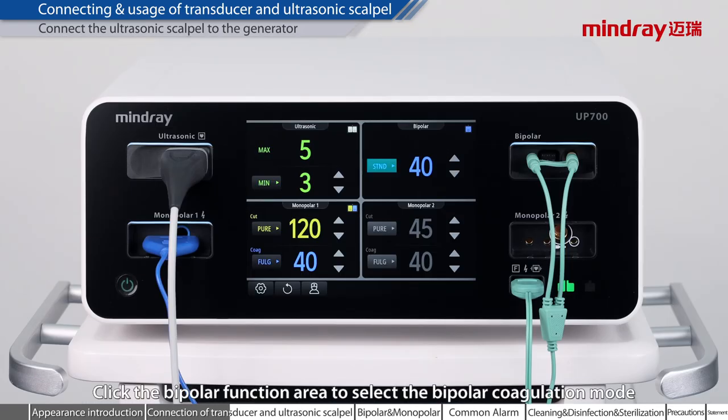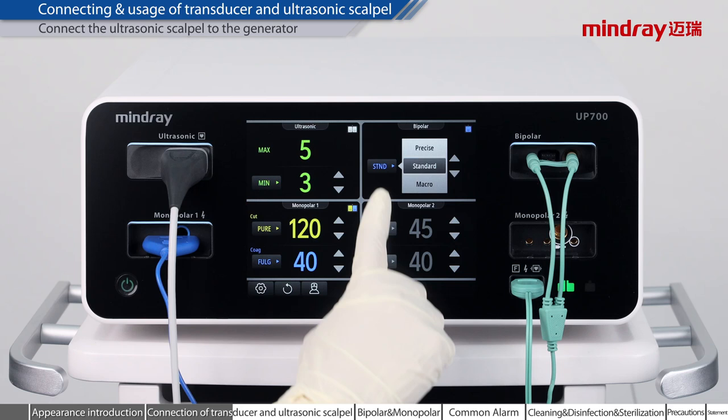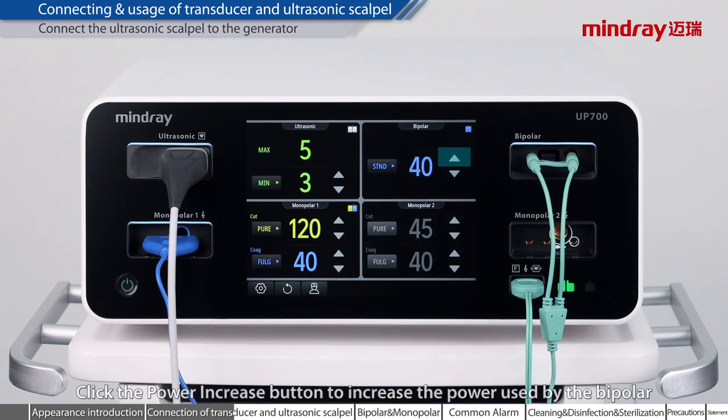Click the bipolar function area to select the bipolar coagulation mode. Click the power increase button to increase the power used by the bipolar. Click the power reduction button to decrease the power used by the bipolar.